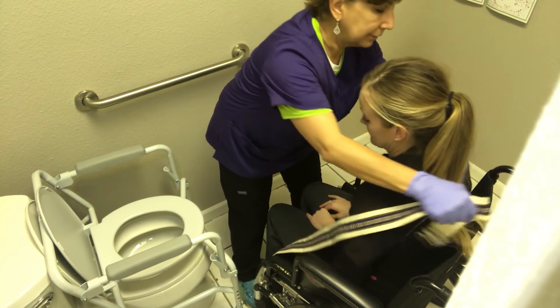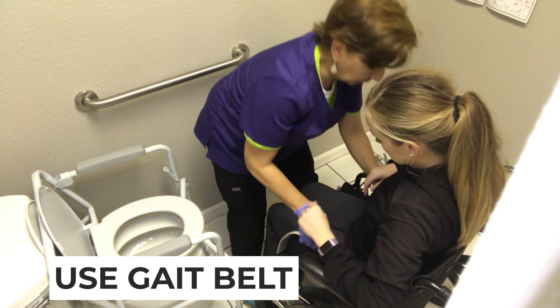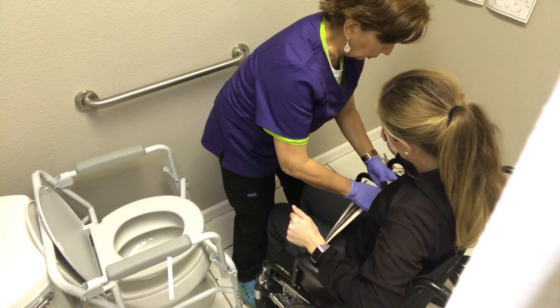I'm going to put the gait belt under them. You want to put it below the ribcage and as snug as you can — it gives you really good control.